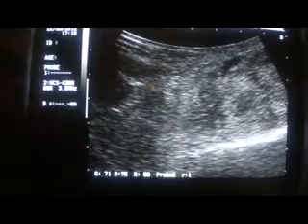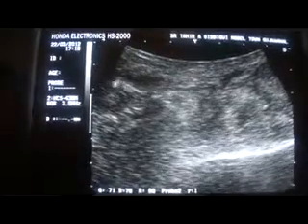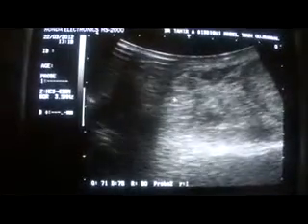And this is the left testis. Fluid collection also with this. You can see bowel loops intruding into the scrotal area in close association with the testis, and you can see a small amount of fluid also. So this is a study of scrotal hernia.